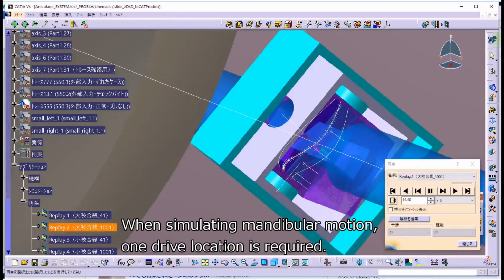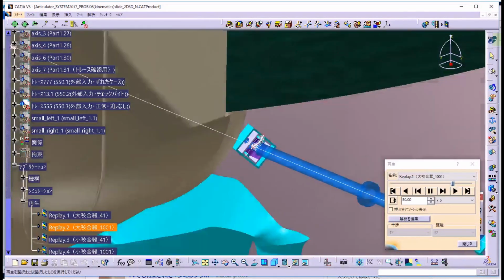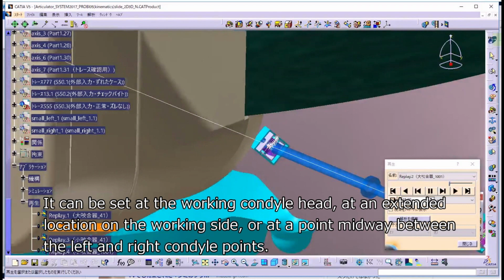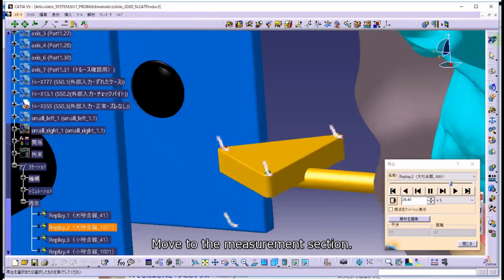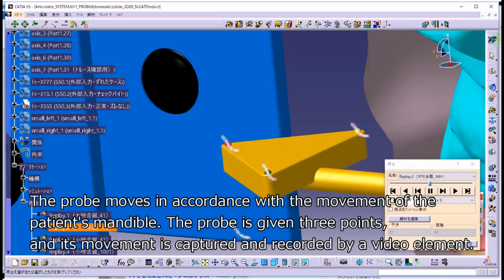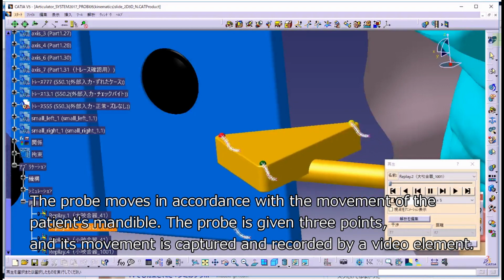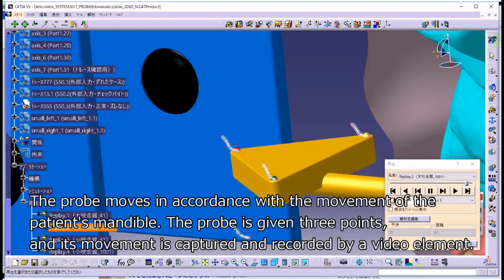When simulating mandibular motion, one drive location is required. It can be set at the working condyle head, at an extended location on the working side, or at a point midway between the left and right condyle points. Move to the measurement section. The probe moves in accordance with the movement of the patient's mandible. The probe is given 3 points, and its movement is captured and recorded by a video element.